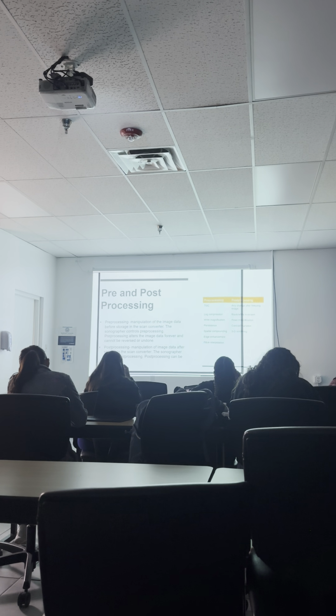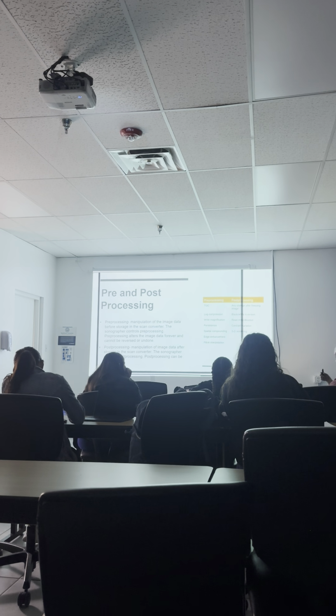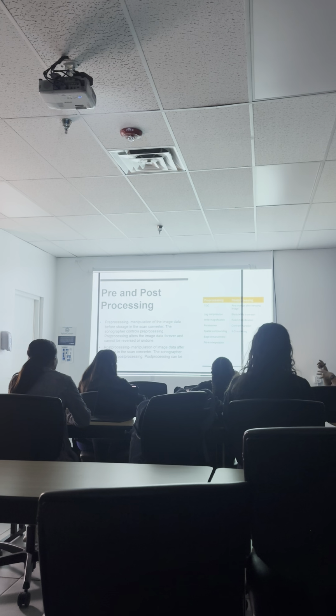What is 3D rendering? Like filtering it? Kind of. So 3D rendering is what we do when we get the 3D images of the fetuses. What it's doing is it's taking a scan this way, a scan this way, and a scan this way, and it's putting all of those scans together to make a 3D image. Once you freeze the image, the information is gonna stay on the machine, and then the machine's gonna interpret it to make the 3D image.